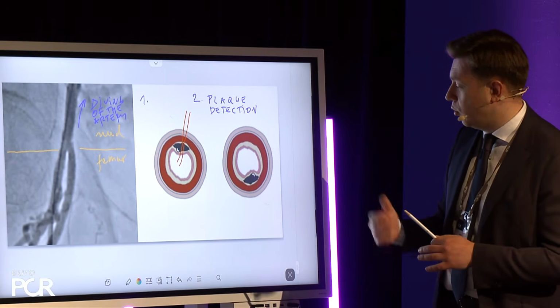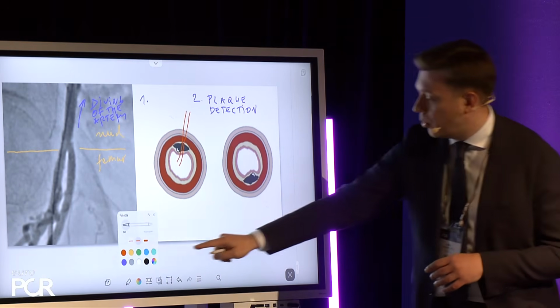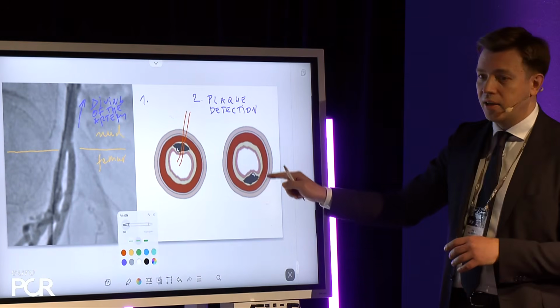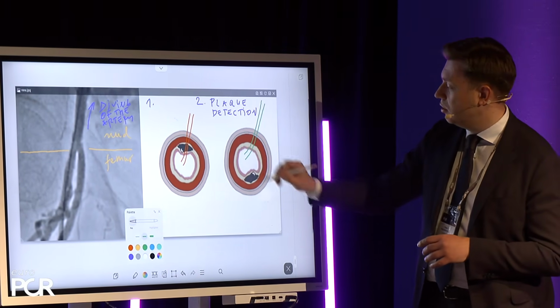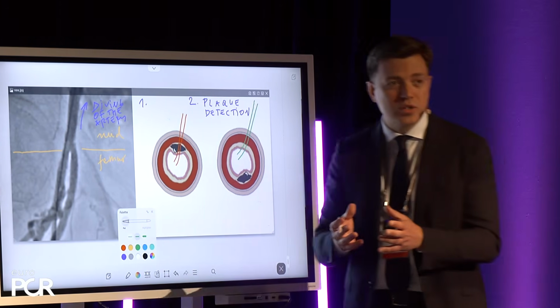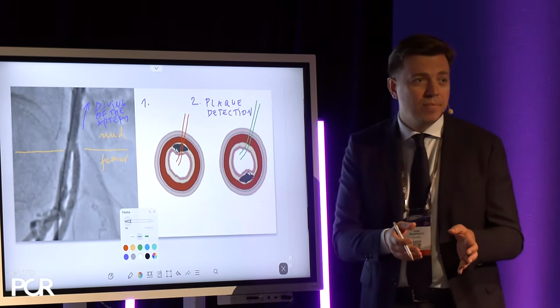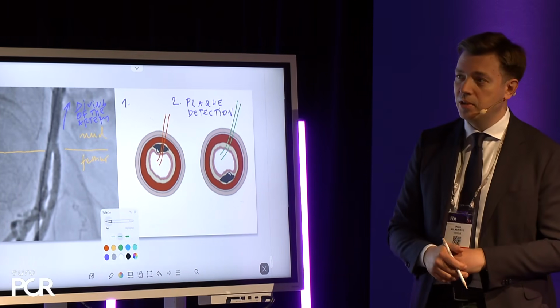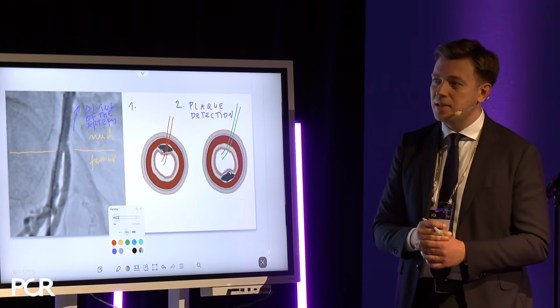So of course, with the ultrasound, you avoid that by finding a spot which can have a plaque on this side, so that you can safely puncture here, where there is no dead plaque. That is, I think, how ultrasound guidance really helps if you want to use the suture-mediated Perclose. But Ole, please maybe continue with the mechanism of deployment.